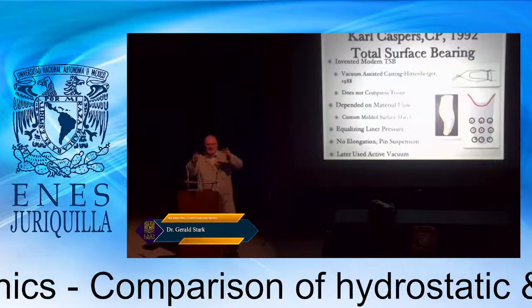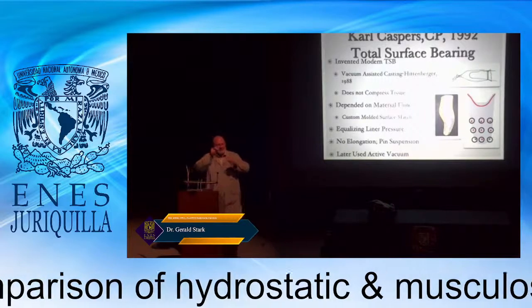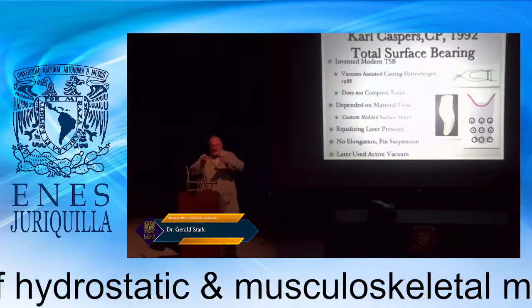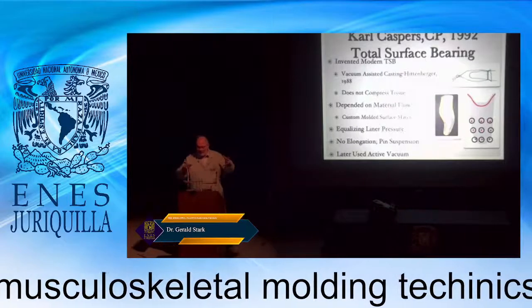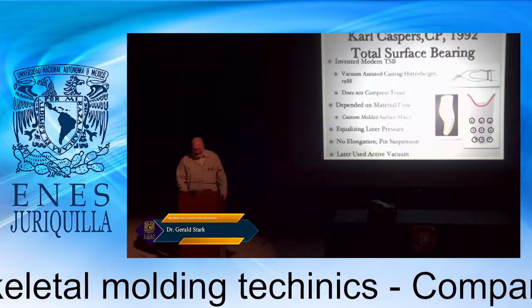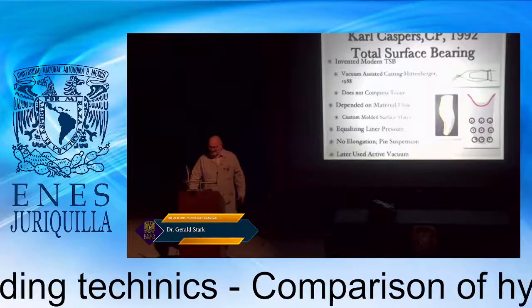Human tissue is more like a sponge that you can compress, right? Because there's micropores inside of the tissue, and the more you load it, the more you increase the pressurization. Sometimes you'll encounter patients that have lost quite a bit of weight, and their tissue really compresses quite a bit. So that's the craft of it that still might be part of prosthetics and orthotics.